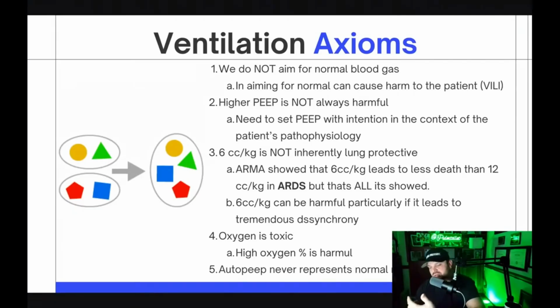So like, treating the pneumonia, giving diuretic, whatever it is. And then the last one, which unfortunately the box sort of cuts off, is that auto PEEP is never normal mechanics. So I've interacted with some people recently that don't sort of respect auto PEEP as much maybe as I do.